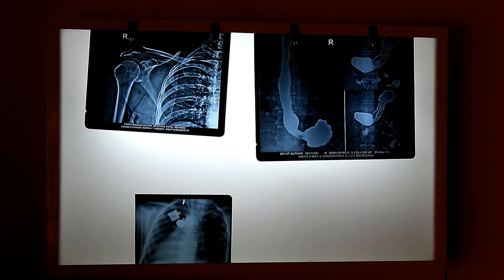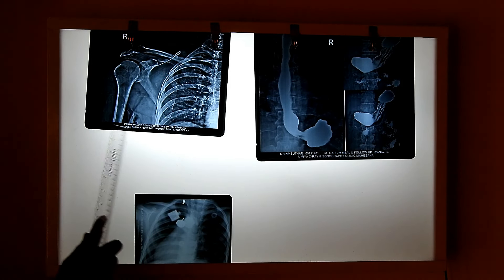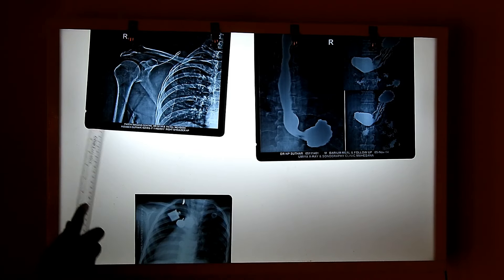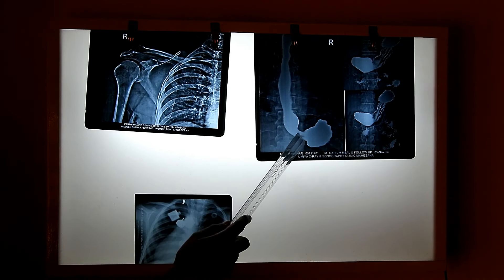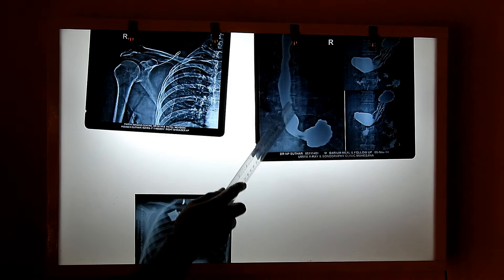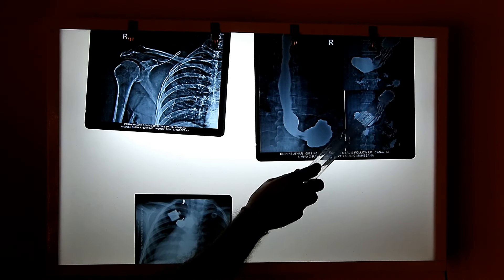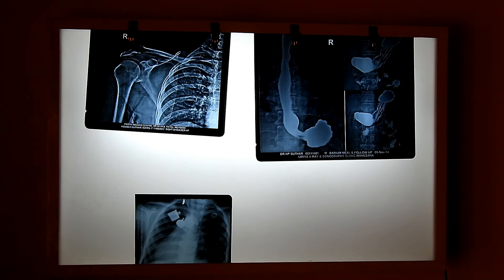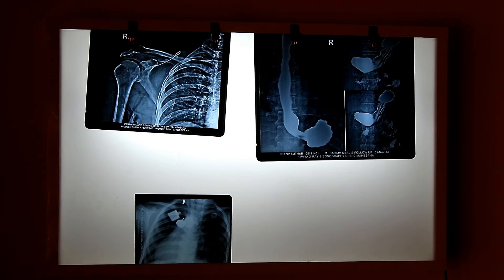After identifying the type of film among these four, the second thing to identify is whether it is a plain type or a special type. In the special type of X-ray, there is use of a radio-opaque dye, which will outline different structures or organs so we can easily see their outlines or any anatomical abnormality. In the plain type, no such dye is used.